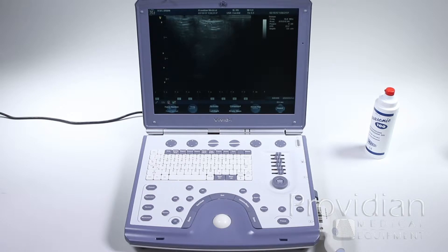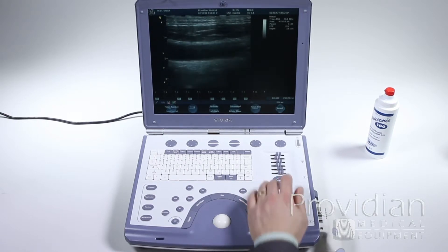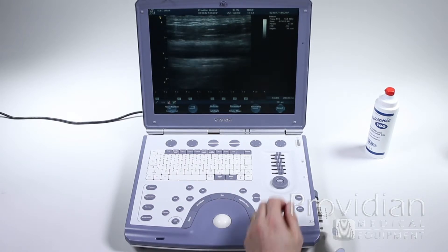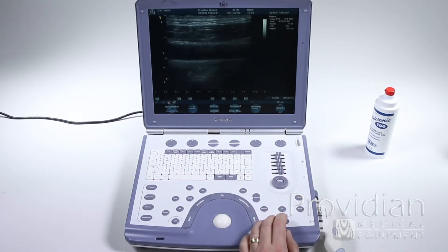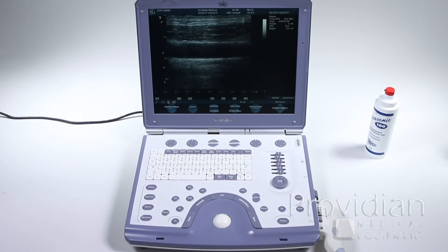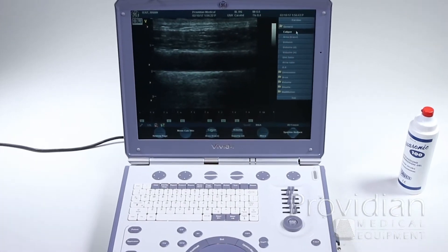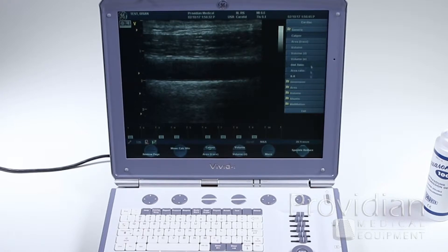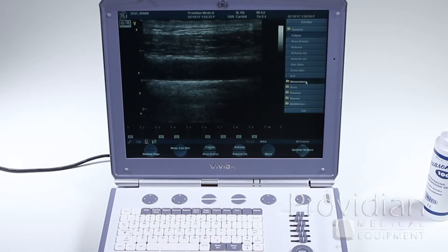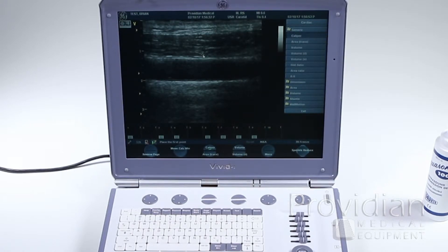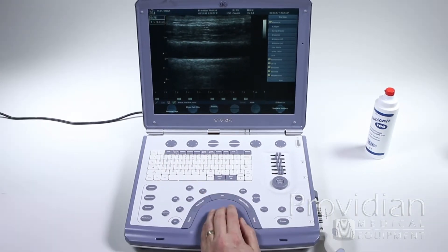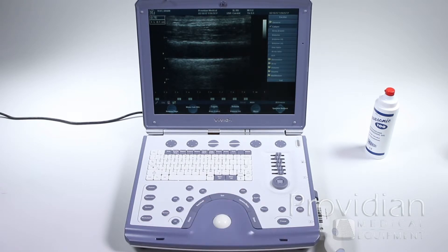For measurements and annotations, start quickly with some basic 2D measurements. Just get a real quick image up on the screen, then simply freeze and press the measure button. Here you have all your available measurements. If you want to do a quick measurement, use the caliper — just click set and then set to make your measurement. Store the image and move on. That is for your most basic imaging.